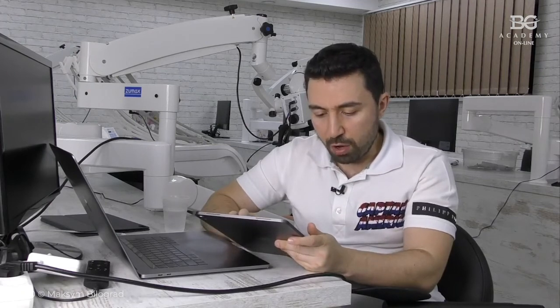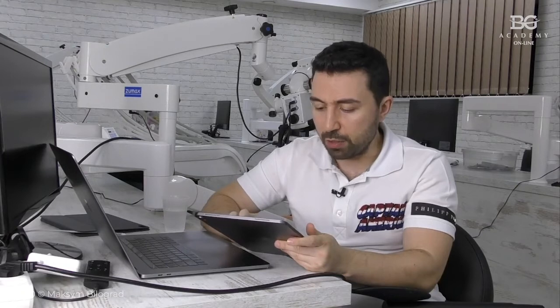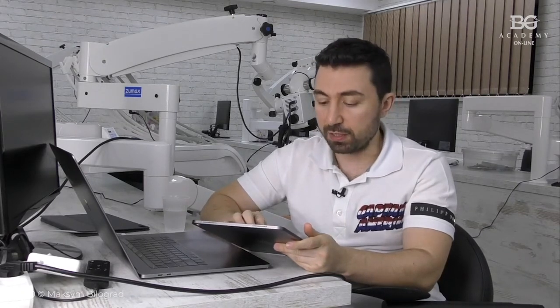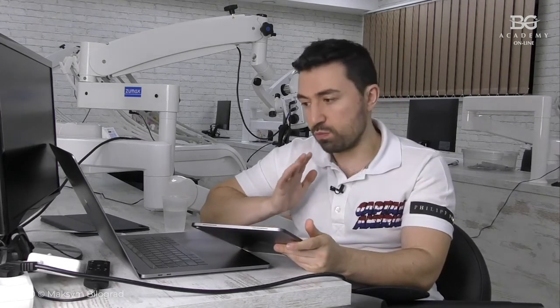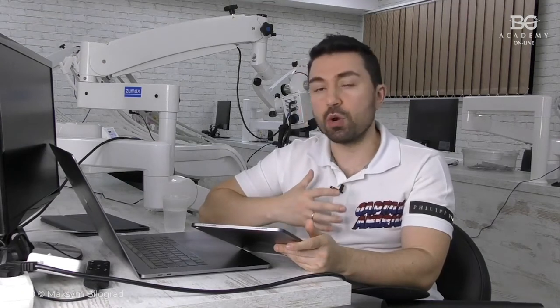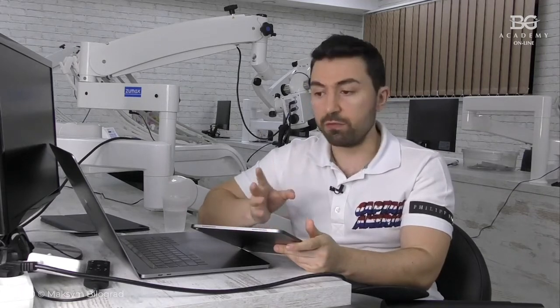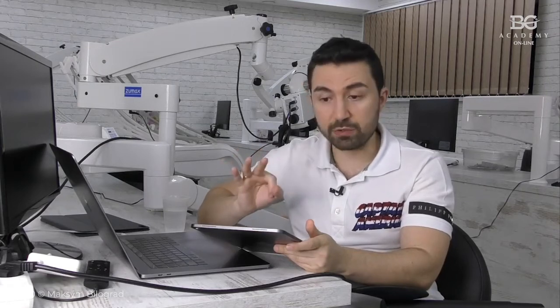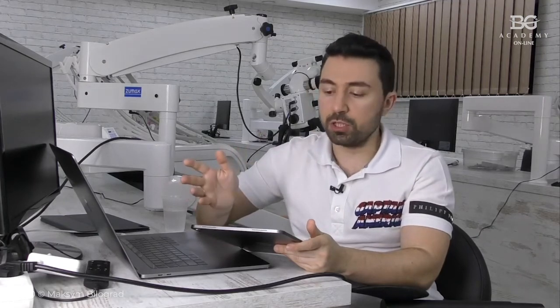Another question from Mohammed. If we have a bad placement of the veneer after light curing, how do we remove it safely? If there is a really bad placement after light curing, that means you didn't control placement well. I did my best to show you all the protocols, all the steps, how you can control and be confident that your veneer sits correctly. Three types of control, I explained that. But if it happened, in this case you unfortunately have to redo.